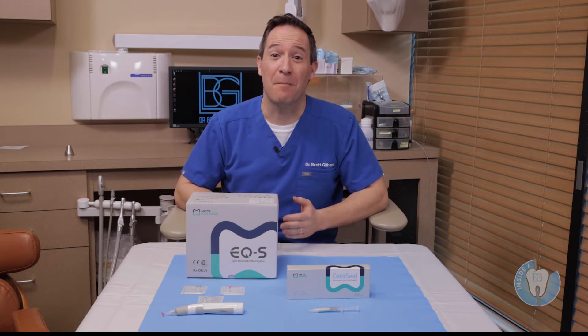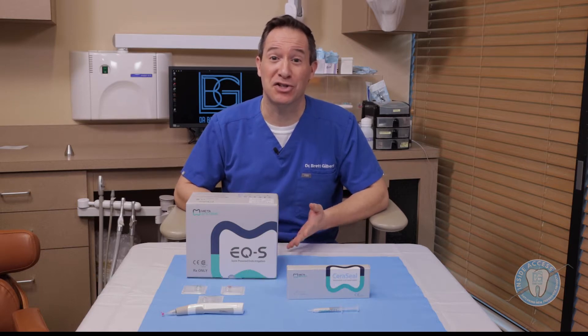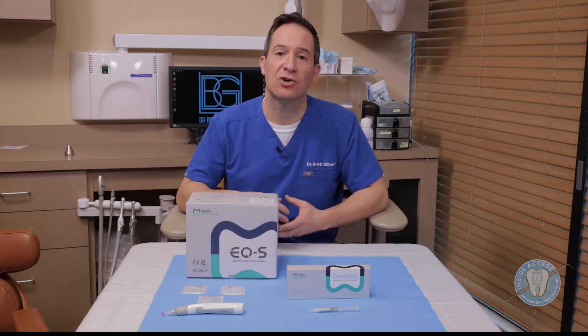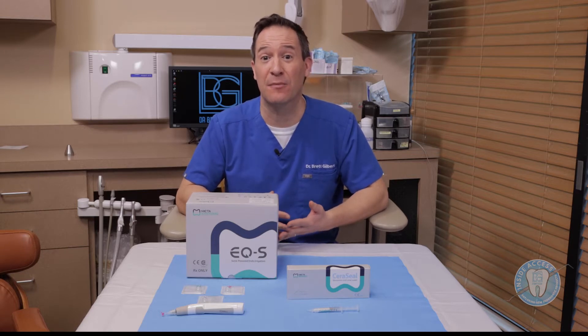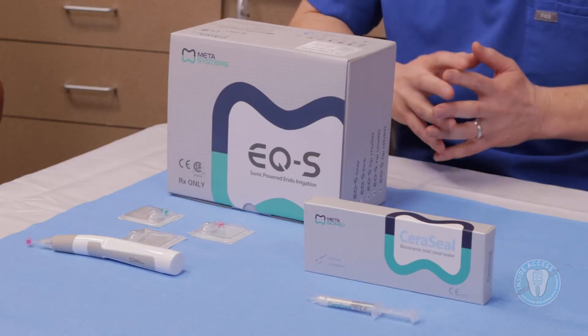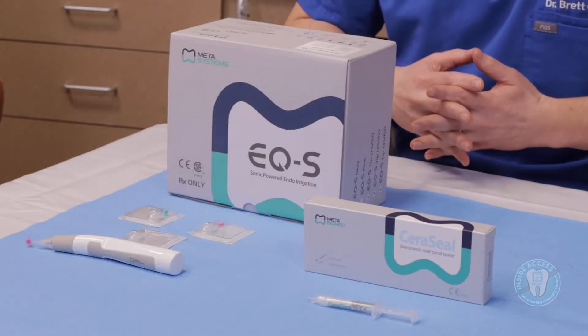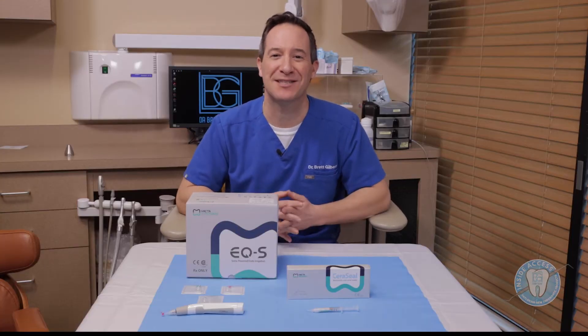This episode is devoted to products from MetaBioMed. MetaBioMed is a company out of Korea, and they have some interesting products that I've been using in my practice that I wanted to share. The first is the EQS, a handheld activator for irrigation to create stimulation and agitation of the solution to get higher cleaning effectiveness. I'm also introducing the Ceraseal product, a silicate-based bioceramic sealer used to seal the canals.